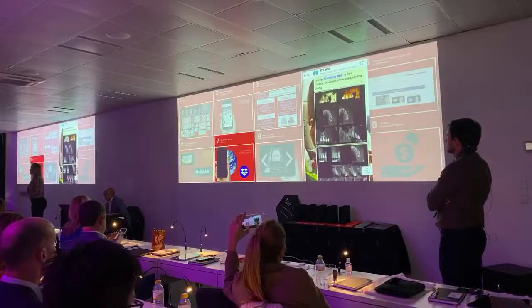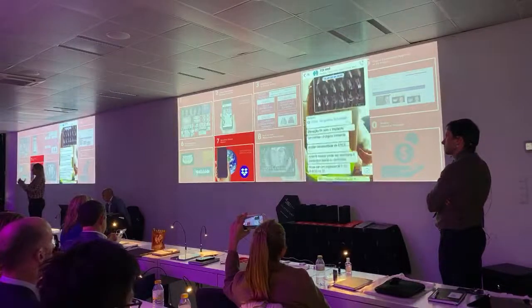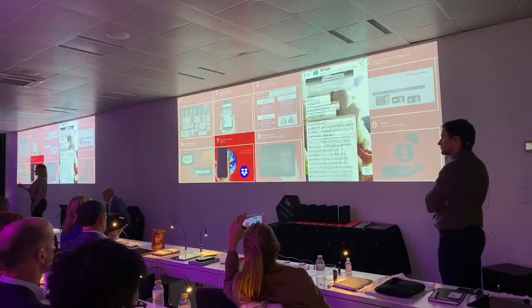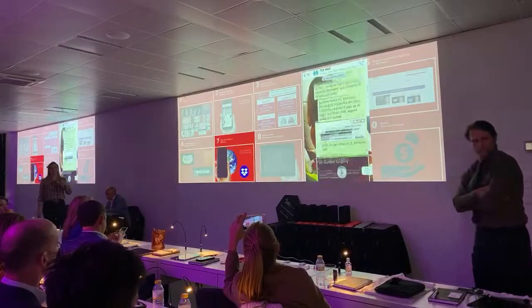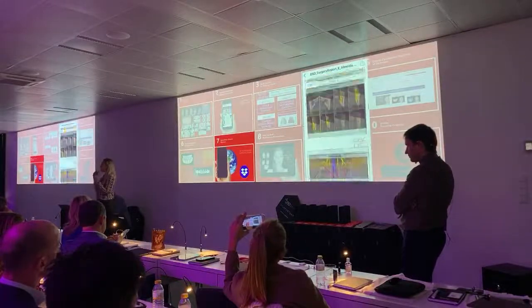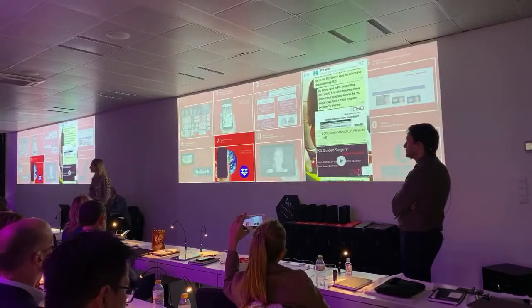Yes, I can. You can modify as many times as you want. Even if you sell the case, but now I want a little change. You just type in the web and they will change. No, you can accept. They will change if necessary. No, you can change anytime. Anytime you want. Okay? Sometimes I'm doing the mock-up, the patient loves everything, but says, look, I would like just a different form. Can we change? And then we change and test again. Now it's another mock-up that I'll do, a technical one, and we do changes, okay?